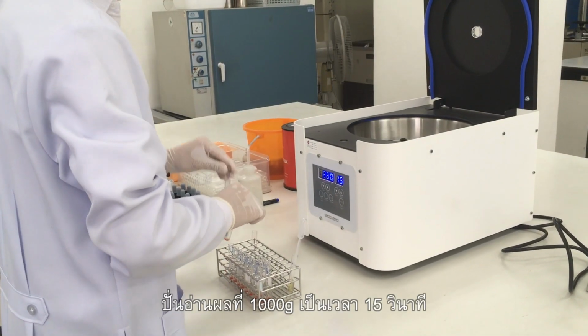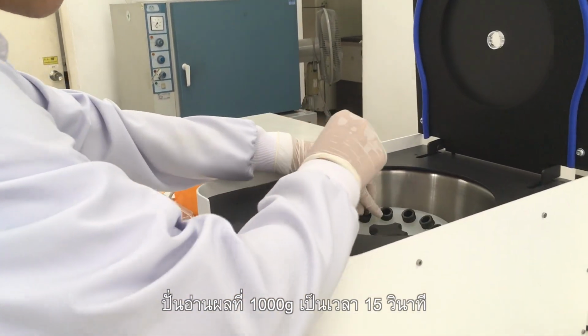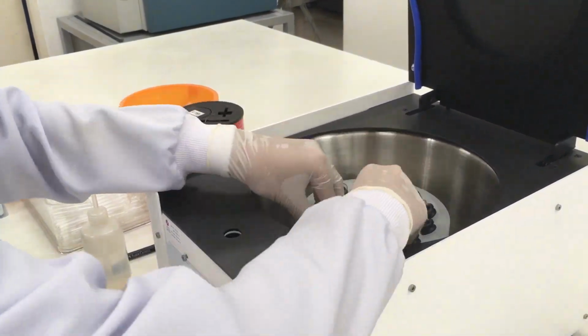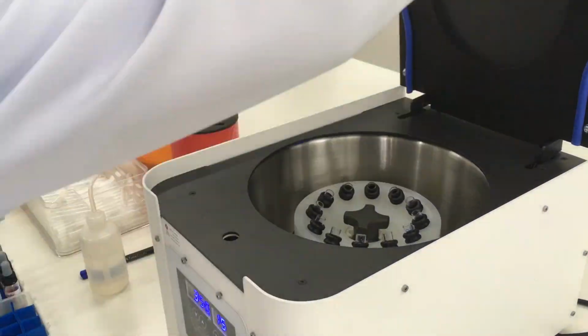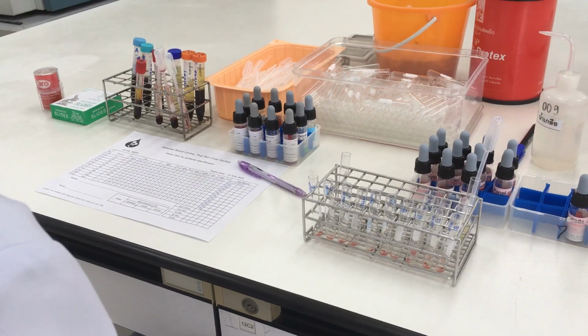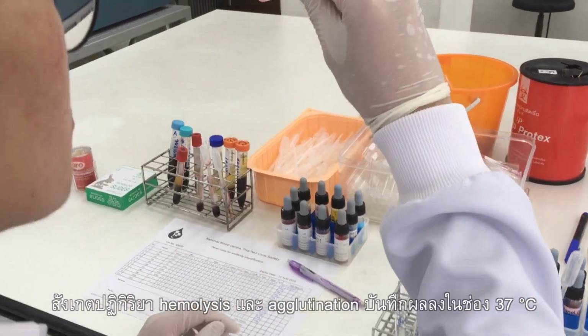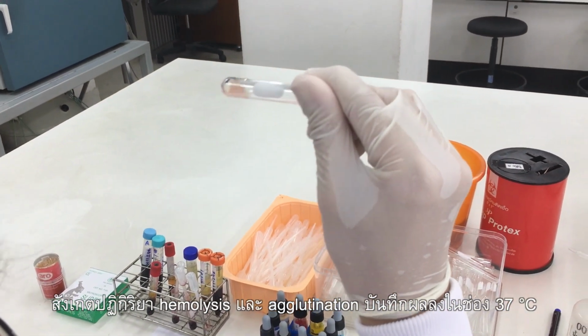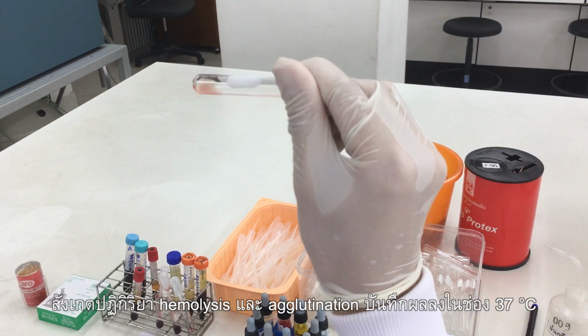After completion, centrifuge at 1000 G for 15 seconds. Observe for hemolysis or agglutination and record in the 37 degrees Celsius phase.